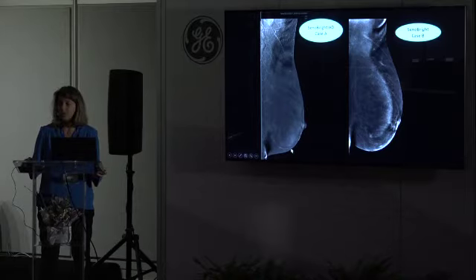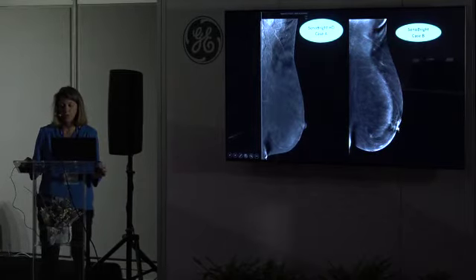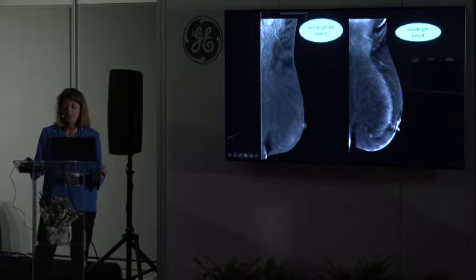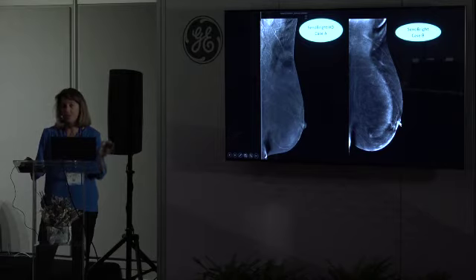the uptake of the skin disappears. It's also an artifact. Here you see the contrast of the skin, and also the normal contrast uptake of the nipple, which sometimes could be more difficult to interpret, especially if you have a lesion located on the subareolar area. And here, you don't have this physiological uptake. It's very, very low. So if you have a lesion here, you will see it more clearly.